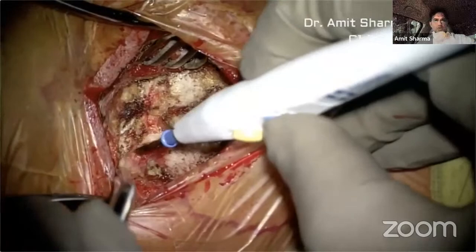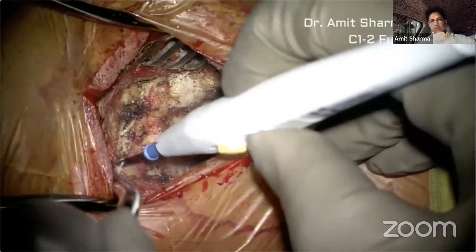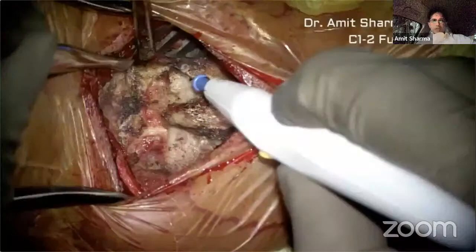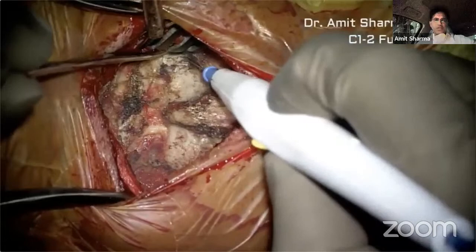So once you are done with the exposure, you proceed with the exposure of the C1 lateral mass. Now, one of the important things is that when you enter this C1-C2 facet joint area, it's better to either pack or do a bipolar cautery of the epidural vessels, the venous channels over there, so that the bleeding will be minimized.